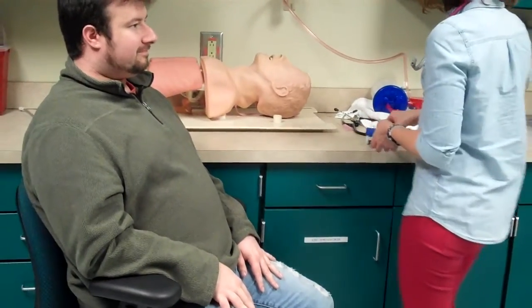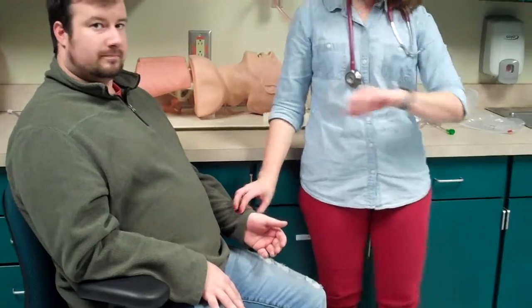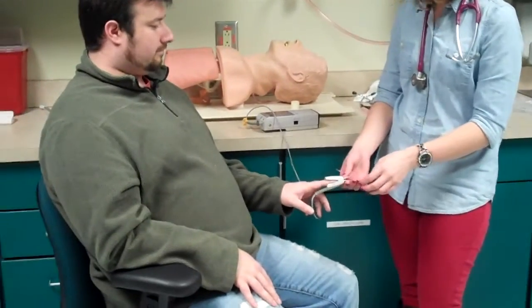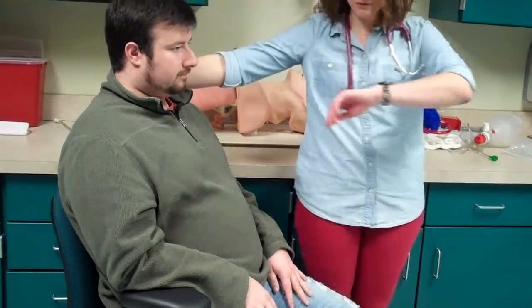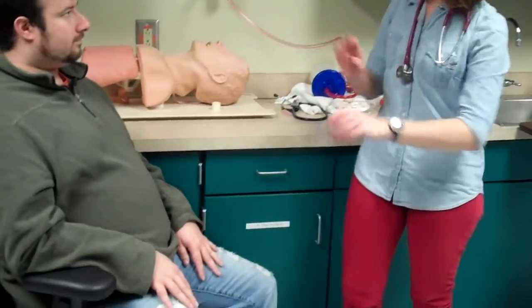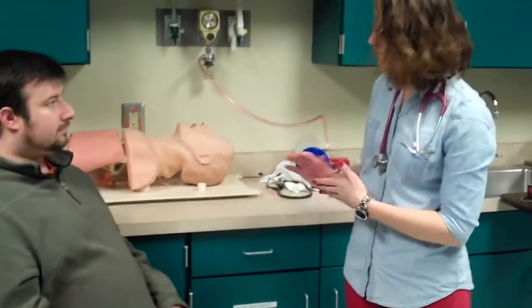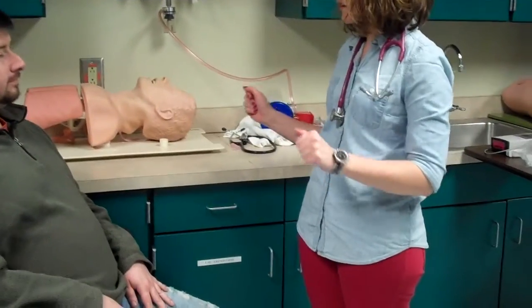Good. Alright. I'm going to check your heart rate again. That's good. I would check your saturation again. 98%. Perfect. Good. Check your respiratory rate again. 14. Alright, that's probably about normal for you. That's good. And color, still looking pretty pink, that's good.